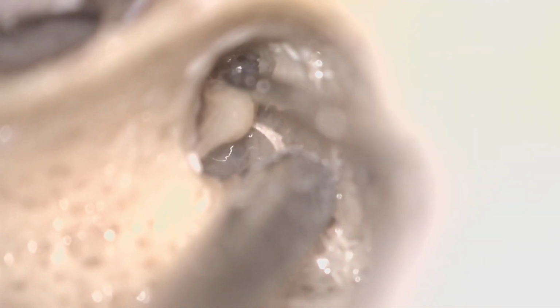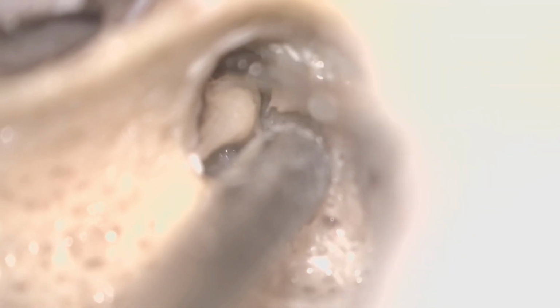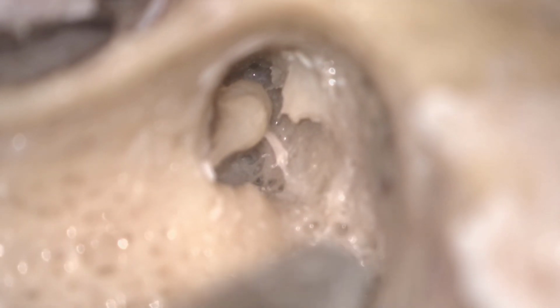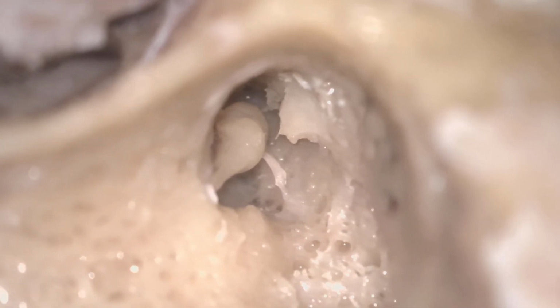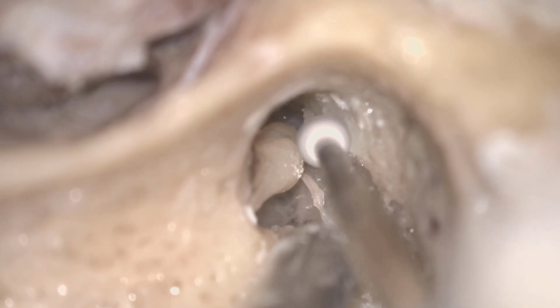So after that part you are going to the anterior epitympanic space. This is the anterior epitympanum and here is the posterior epitympanum and this structure is the cog. We will remove that bone, then the cog area will be more clearly visible. Look. Water.